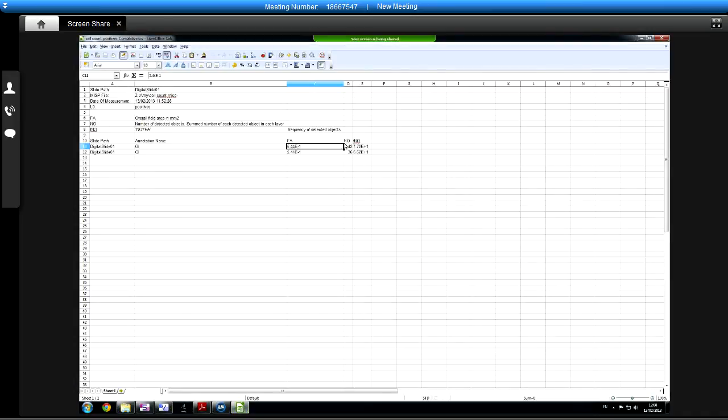There's 42 objects. You see the second time it's less because we tweaked it, and the frequency has therefore gone down. So you can imagine if we had all those other parameters there, or if we'd marked lots of areas, each one would be a separate area. So does that give you the sort of thing you're after, you think? Yeah?